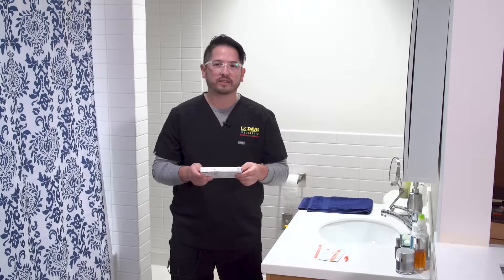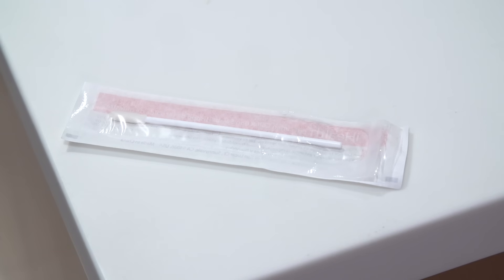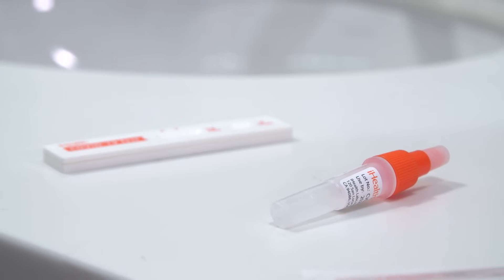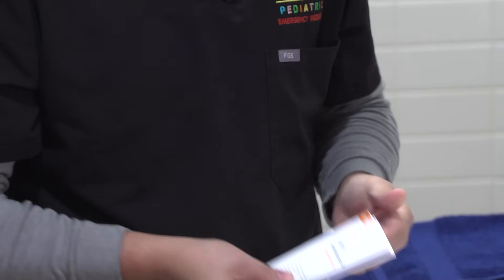In the kit comes two tests and we'll go over each part of it. You'll have your collection swab, your test card, and your dropper and liquid that you'll use later. Before you begin it's always really important to look at the instructions as some tests can be different. Make sure you wash your hands thoroughly with warm water and soap for 30 seconds.